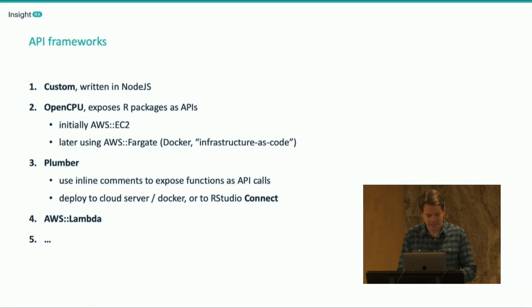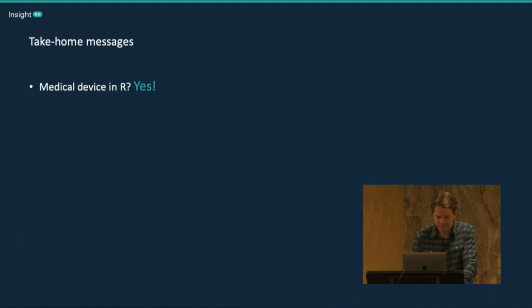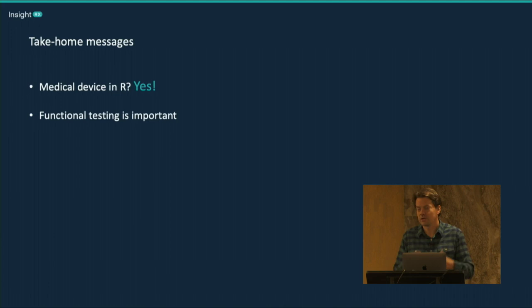So to round off, I think, the main question, medical device in R, if there was a question mark in anyone's mind, I think yes, it's not a problem. There's no regulatory requirement that actually says you have to develop your tool in a specific language.